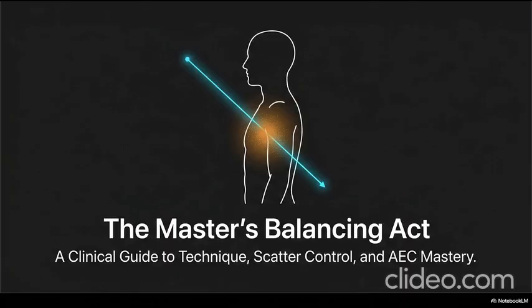Yes. The intuitive visual feedback loop that governed radiography for a century, the immediate realization that a dark film meant too much radiation, has been completely severed by software correction. So how does a modern radiographer even know they messed up if the picture looks great? They have to look beyond the image itself. They must monitor their digital exposure index values.